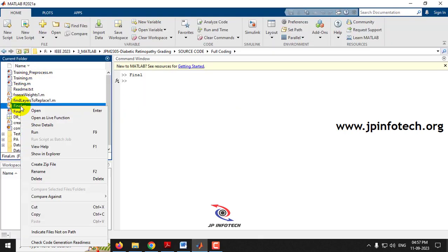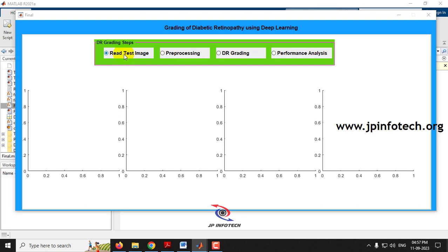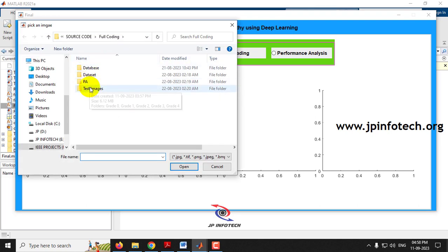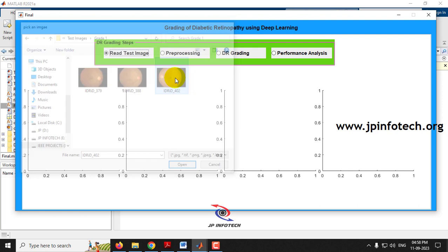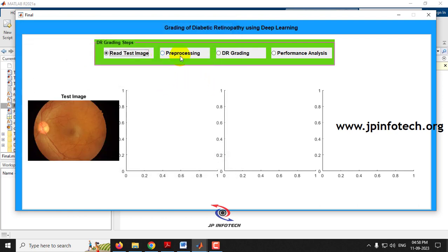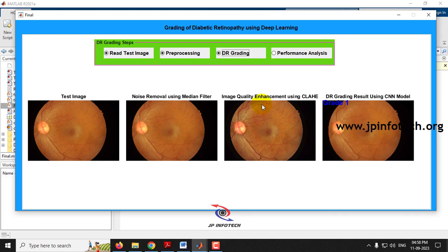Running the project again, reading a test image from Grade 1, then applying pre-processing — the pre-processed image is displayed. Running the DR grading step loads the trained network model into the system, and the image is classified as Grade 1.